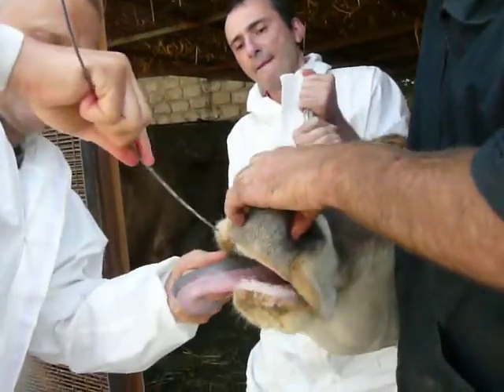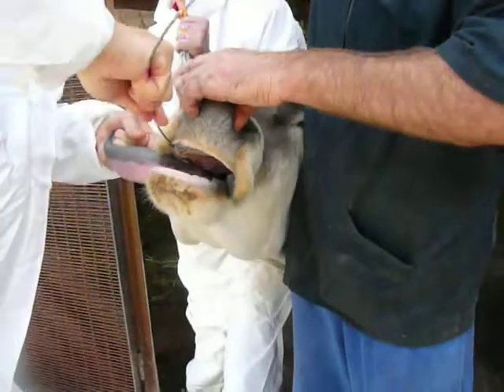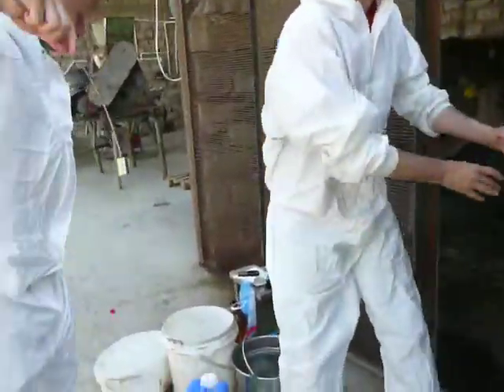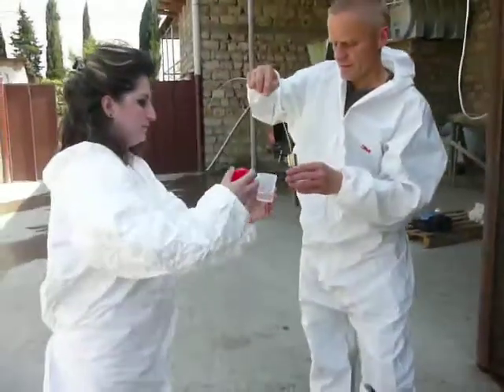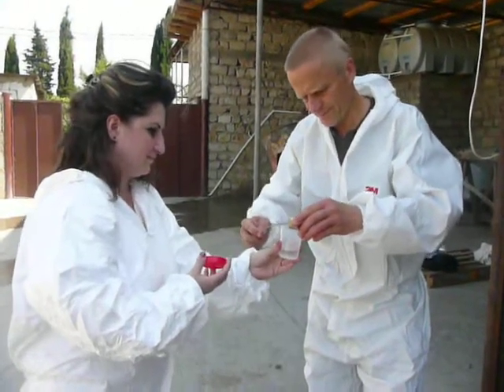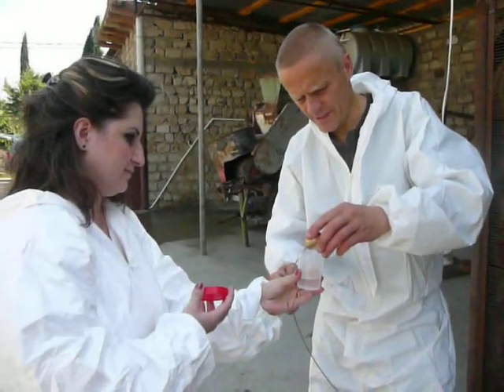There is what you have. Then we put it in a container with buffer medium. It looks nice and clear.